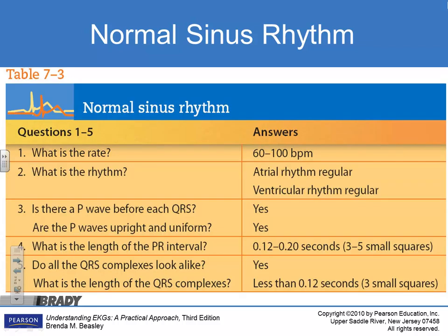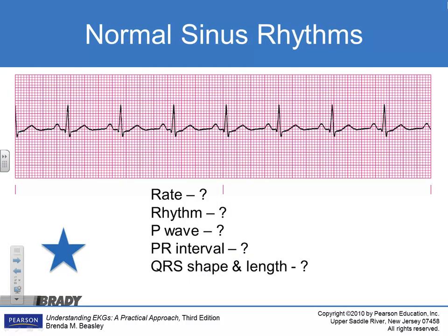Same thing again. And I have a couple really good charts I'll put on the website for you that should help you with some rhythms. All right, let's see. All right, I want you to look at this rhythm, figure out the rate, go through the 5 steps there, and then I have a question after that.